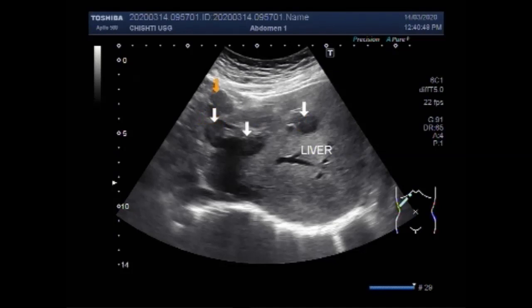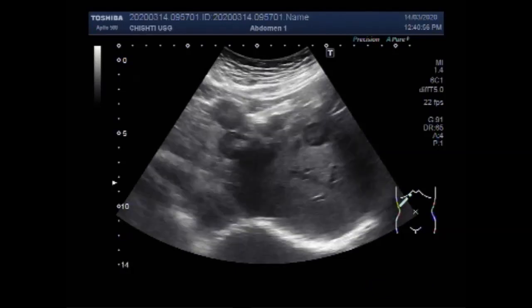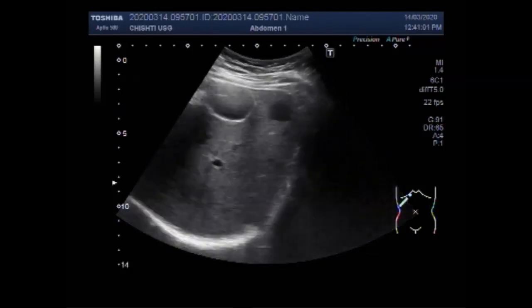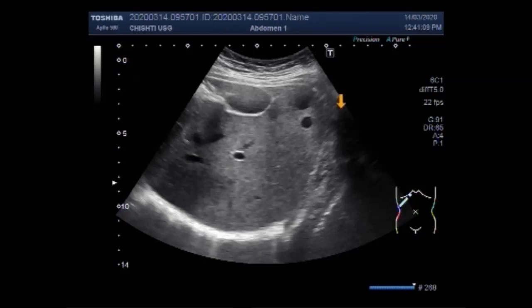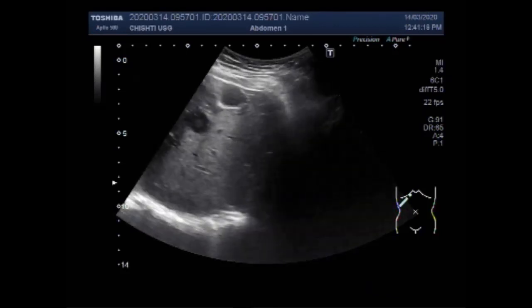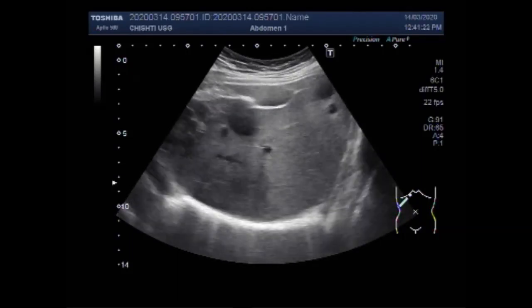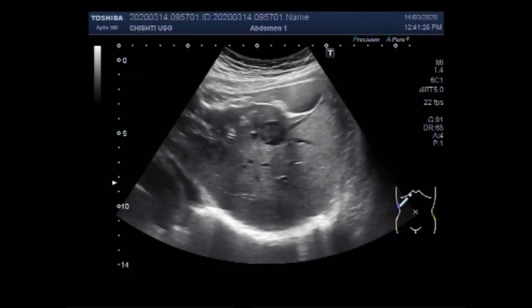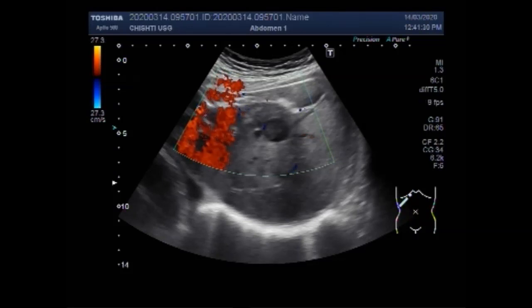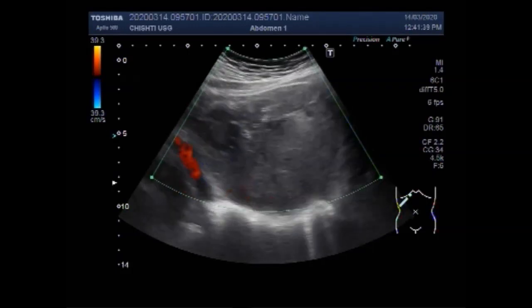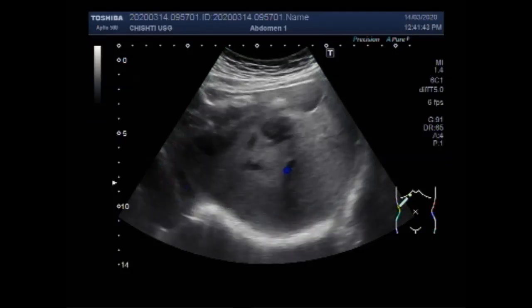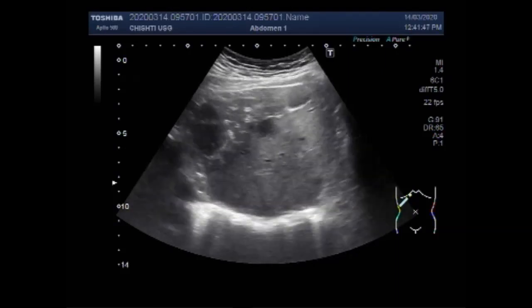This is the liver with multiple metastases in the right lobe of the liver — these are the bull's-eye shape. You can see the liver and gallbladder, with smaller and larger secondary metastases in the upper portion of the right lobe of the liver. Prognosis for liver metastasis tends to be poor, with roughly an 11% survival rate at 5 years. Treatment can help reduce symptoms and shrink the tumor, but typically there is no cure for liver metastasis.